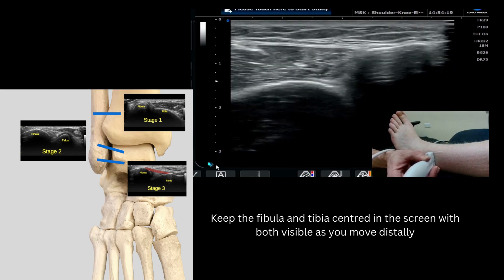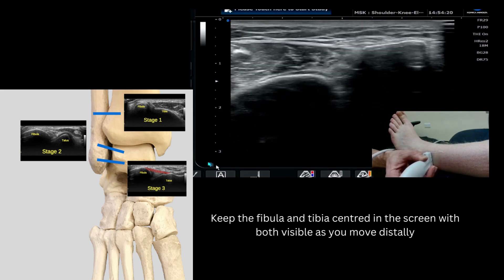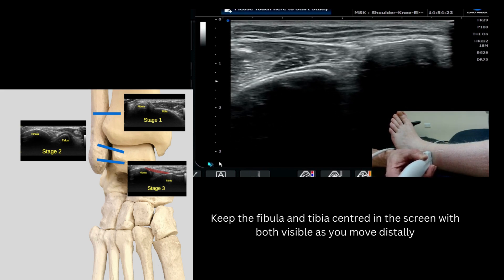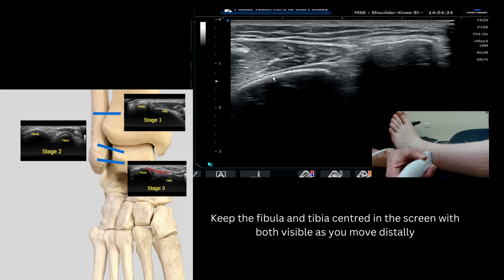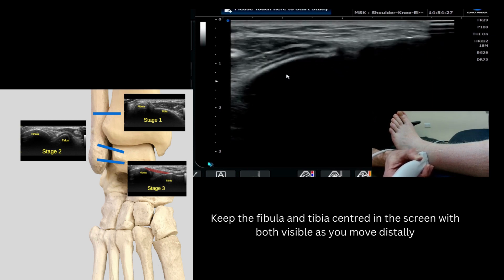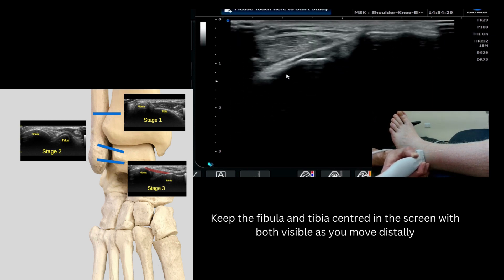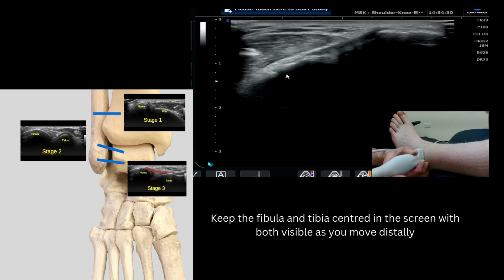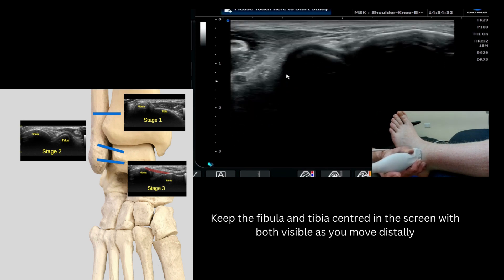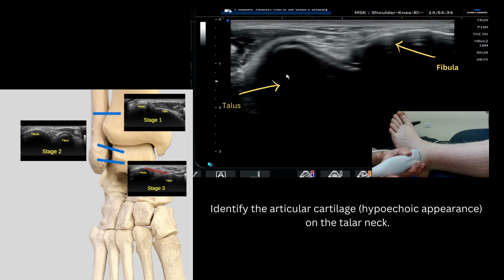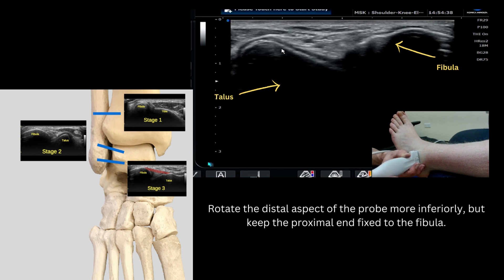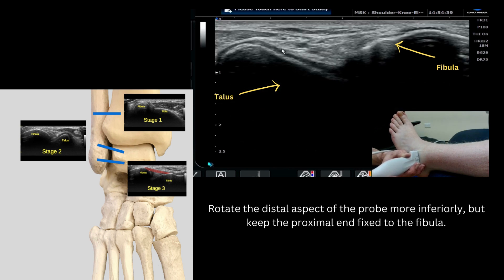As you start to take your probe more distally, those two bones will come together naturally and form what is known as the syndesmosis, and at that point we know that we can find the anterior inferior tibiofibular ligament, which can be sustaining injuries during high ankle sprains.